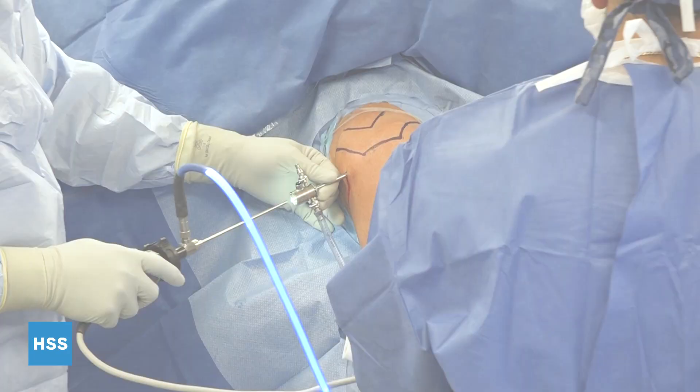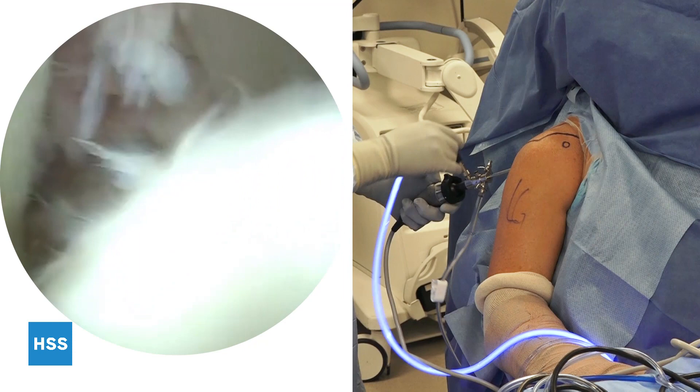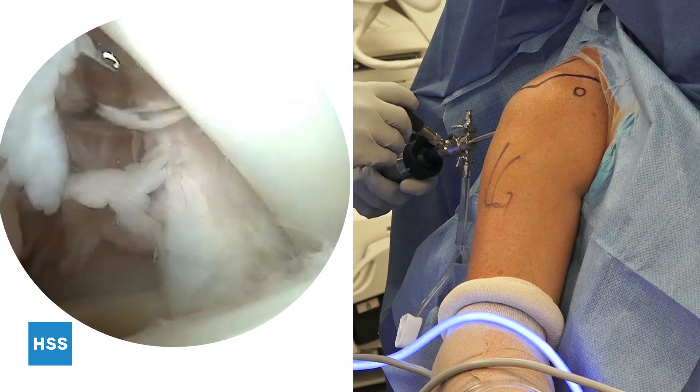We begin the procedure by establishing a standard posterior portal. This is the view inside the joint looking towards anterior — the subscapularis is normal, long head of the biceps tendon is normal. If you forward flex and externally rotate the arm, you can see a good view of the re-rupture of the supraspinatus. Moving around back, infraspinatus and teres minor are okay. We establish a rotator interval anterior portal, just lateral to the coracoid, placed between the supraspinatus and the subscapularis.